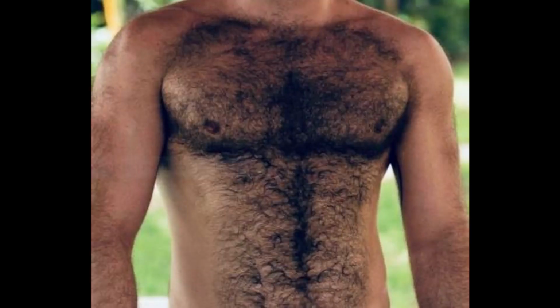Men, if they're hairy, need to shave from the bottom of their chest, the bottom of the rib cage, all the way up to their shoulders so that the hair will not interfere with the ECG tracings. Do not apply lotions or baby oil to your chest for 24 hours before the test, or the electrodes won't stick and we will not get quality ECG tracings.